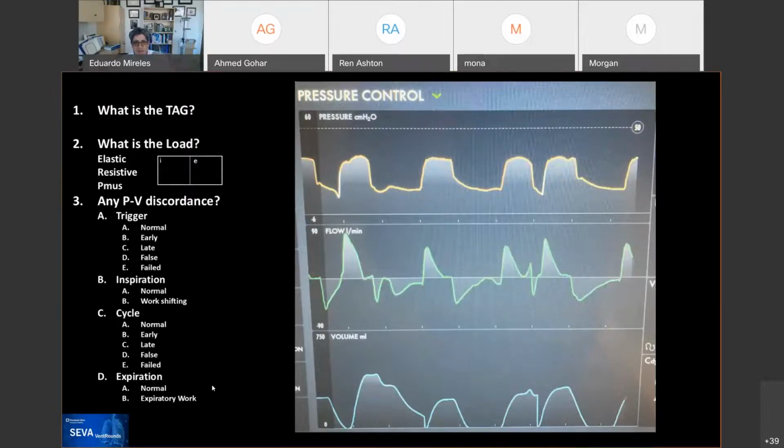When I think about those circumstances in which you just have a high-level view of what's happening to this patient, and the main issue is how the ventilator and the patient are working, the thought is: what modes can help us deal with this while keeping our goals, either safety, comfort, or liberation? All right, you have 20 seconds to finish your answers.